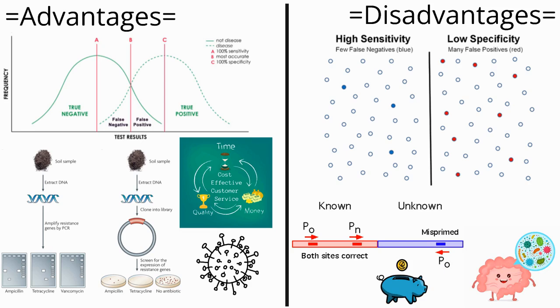The cost of the test in Mexico is approximately 1,650 pesos plus IVA, with a sensitivity of 96% and a specificity of 97%.